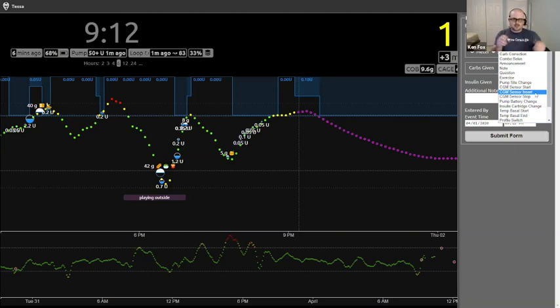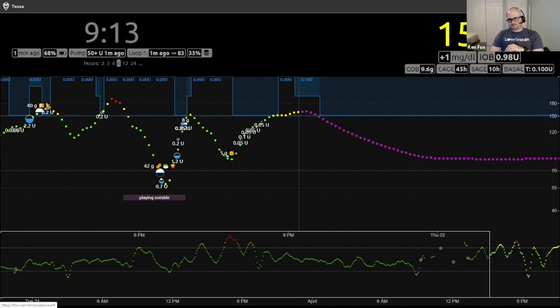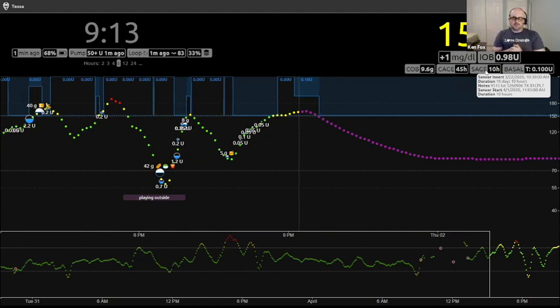Because think of it this way, you're not actually taking the sensor out, so it's still inserted, but you are going through the process in the Dexcom app of eventually hitting start sensor. So the start or insert starts the counter over again, and as long as you leave the same insert activity going, you get the duration showing the whole time the sensor's been inserted in the second line there, and then the sensor start is the last time I restarted it. So it's been restarted for 10 hours. Super helpful for figuring out how long the sensor's actually been in there. I guess partially useful because, you know, if you want to break a record or something, like I was tracking for a while, but mostly just to know how old the sensor is.